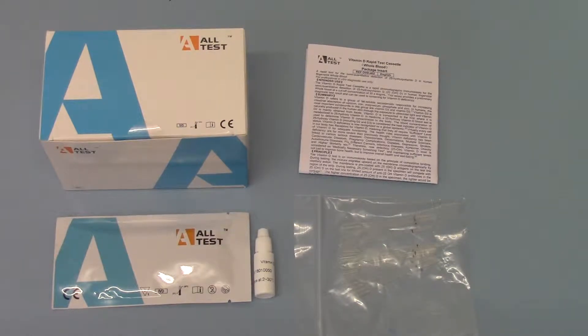Welcome to this product support video, showing you what is included in the AllTest Vitamin D Rapid Test cassette packs. These are new ones on the market from 2018, a new entry into this testing arena for AllTest. This allows for the whole blood, serum or plasma estimation of Vitamin D levels.